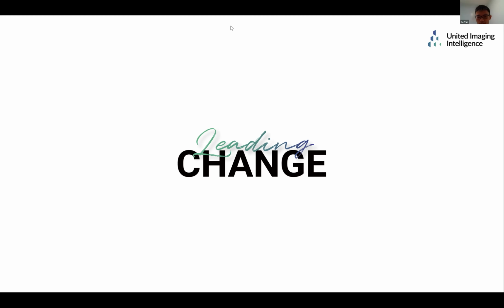Thank you. Next question. Has the inverse FFT in the reconstruction process been changed by the deep neural network? We treated the inverse FFT simply; there are two parts to the reconstruction, and I haven't covered the details. One part is the data consistency. Once we recover the image, we do the Fourier transform to convert the image into k-space, and then we verify the k-space data against the measurement. The measurement is the original acquired k-space data.